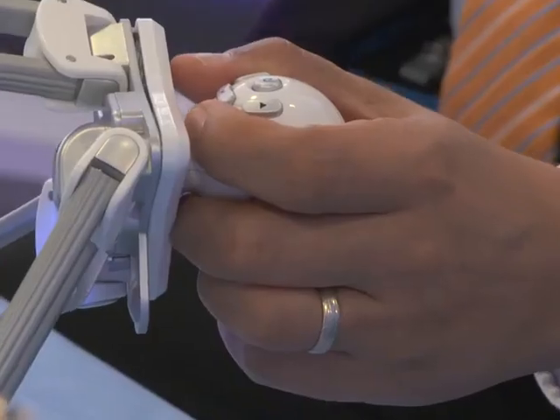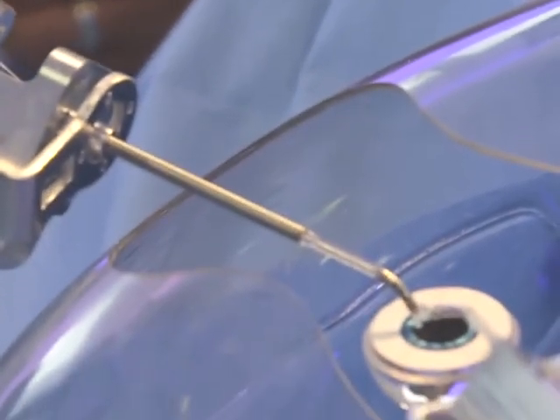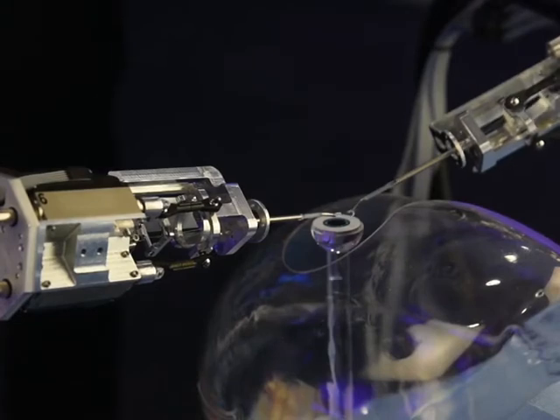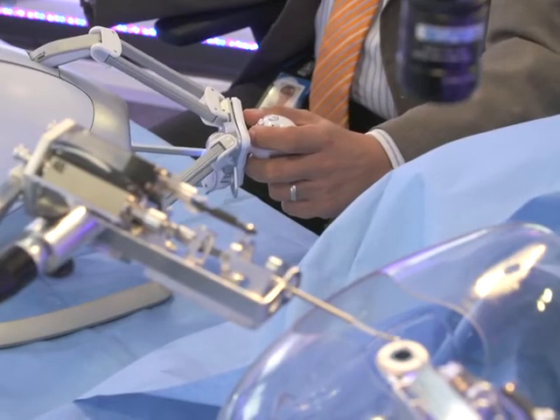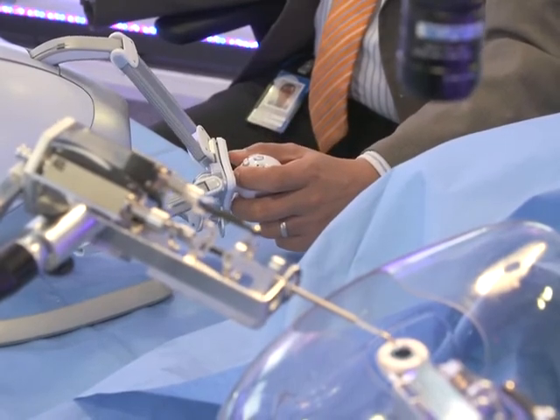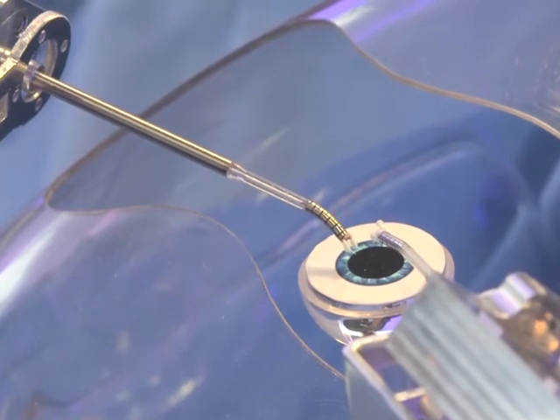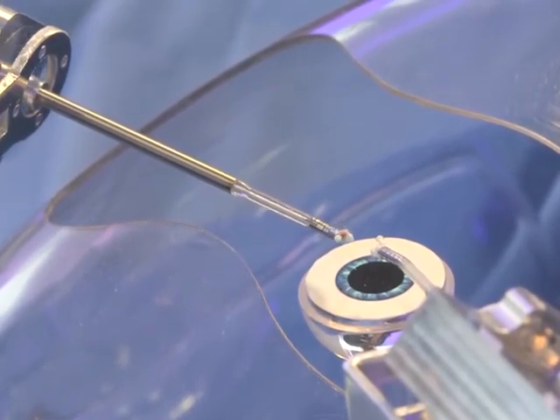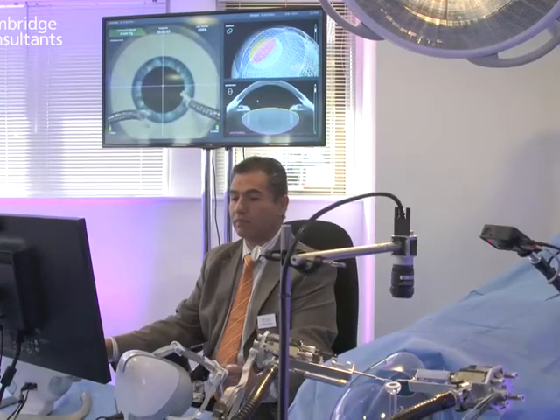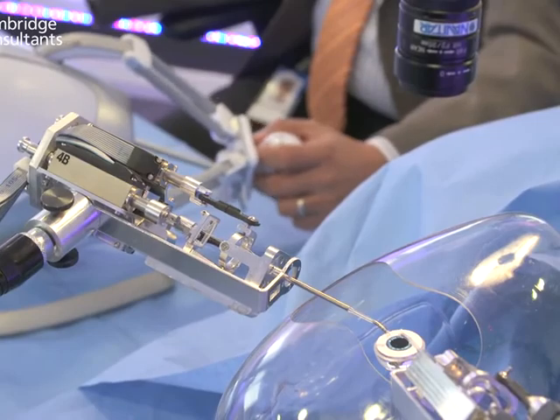That means that the initial motor needs to hold the weight, not just of the tool and the forces that you're applying to the body, but the weight of all of those other motors and links in succession. And so that motor then needs to be very large to carry all the weight of the motors and links further down the chain. And you can imagine as you go back, that makes the whole thing a lot bigger. So we tried to see if there's a way of getting around that aspect. So that's a serial chain manipulator.